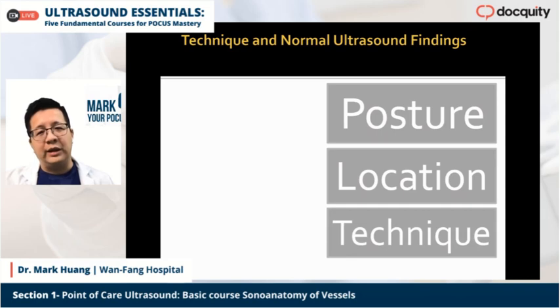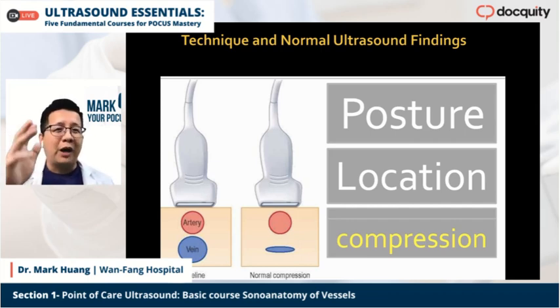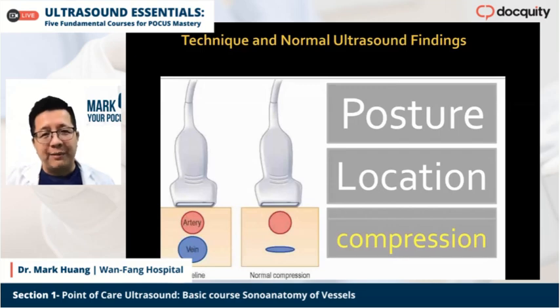We also need to use one manipulation technique, which is compression. If the vein is compressible, it means the flow is smooth. If the vein is non-compressible or difficult to compress, it means there may be a partial or total obstruction above that. So compression skill is quite important.